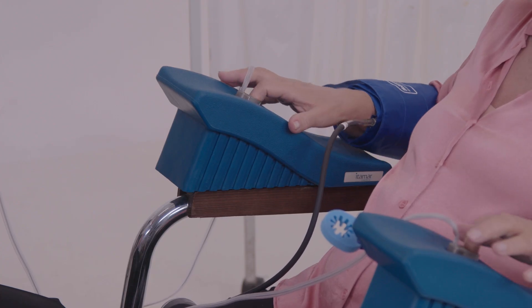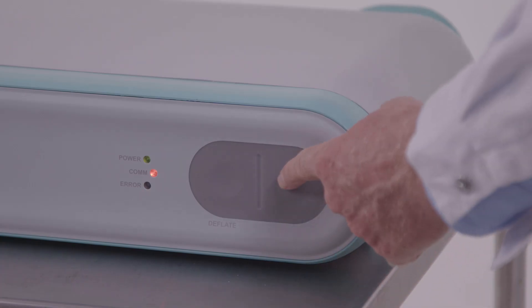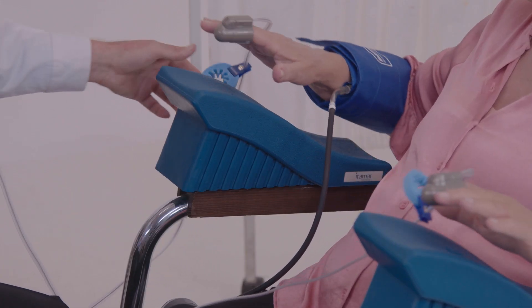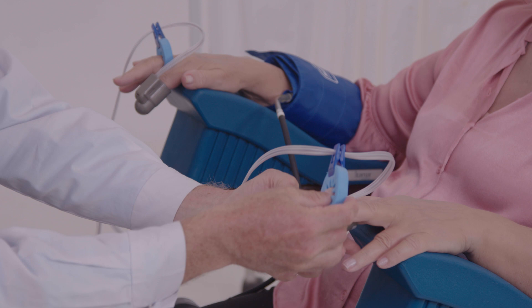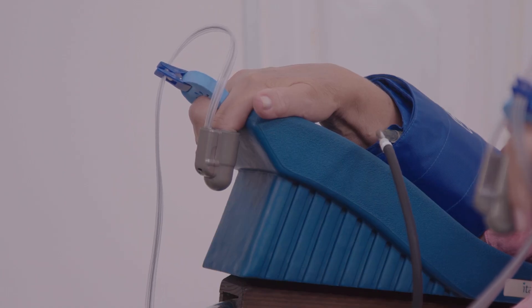Place the selected fingers into the probes, making sure the fingers are inserted all the way to the end of the probe. Inflate probes by pressing the inflate button on the device or the software. Place the blue foam anchoring the adjacent finger to the one with the probe as near as possible to the finger's root. Make sure the tubing forms a loop from the probe reaching half of the palm and back to the anchor, pointing away from the patient. Place the forearms comfortably on the arm support, palm side down and fingers hanging freely at heart level. Tubes should be free of contact with the back of the hand. Make sure the probes are free and not in contact with any object.